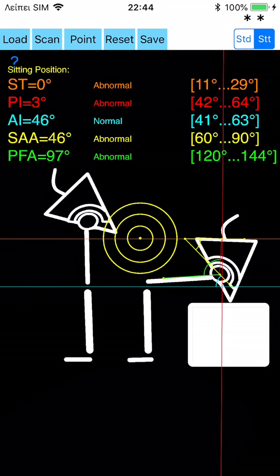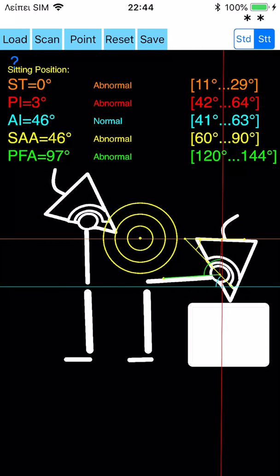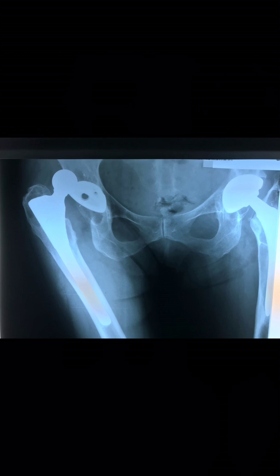The software is a Class II medical device in the FDA. All information received from the software output must be clinically reviewed regarding its plausibility before patient treatment. Spinopelvic Mobility App, indicated for assisting healthcare professionals. Clinical judgment and experience are required to properly use the software. The software is not for primary image interpretation.